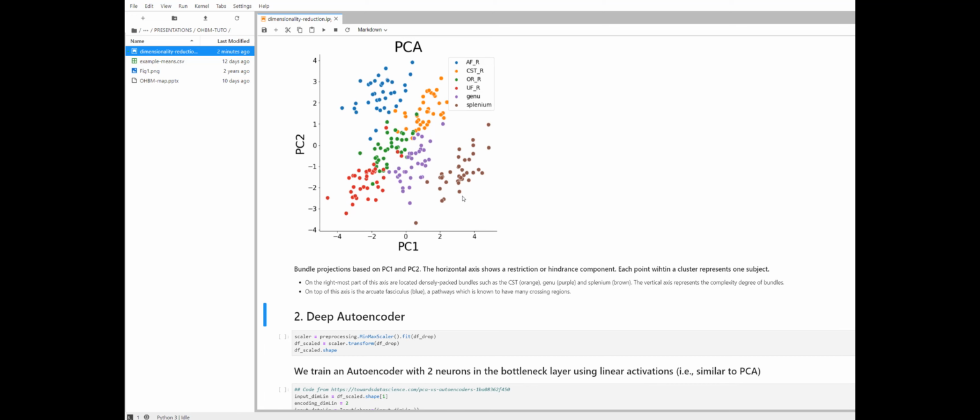But the nice thing about this space now is that for each cluster, one could, for example, compute the mean of the cluster and then compare each point to the mean by computing the Mahalanobis distance. This gives you an individual distance for each of these subjects, to see how the splenium of this person compares to the mean splenium of all of the group in this new feature space that takes into account all of the different metrics. So that's a way of doing single subject analysis using multidimensional data.